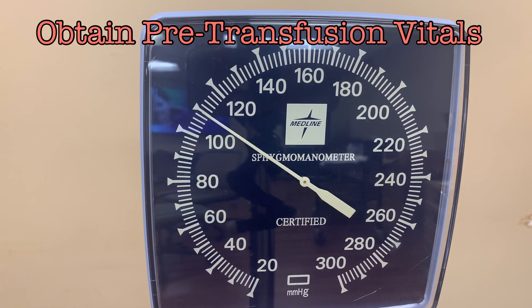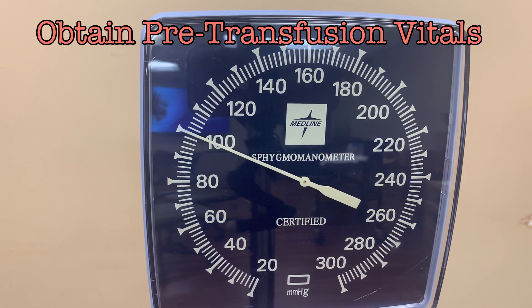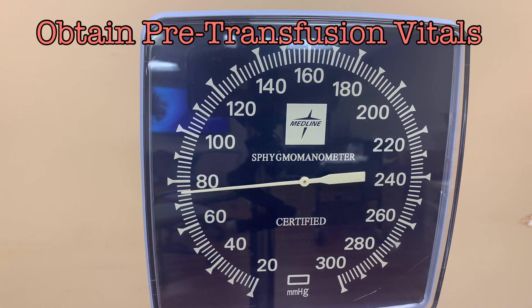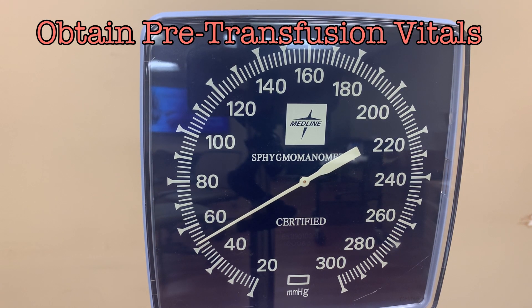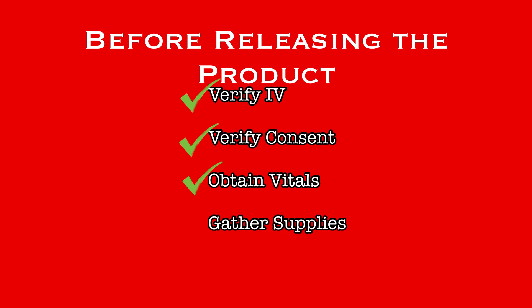Check the patient's vital signs and ensure everything is within expected ranges. If there are any concerns regarding the patient's vitals, consult with the physician before moving forward with the transfusion. Make sure these pre-procedure vitals are entered into EPIC. With an IV in place, consent on the chart, and vitals within expectations, the next step is to gather the necessary supplies.